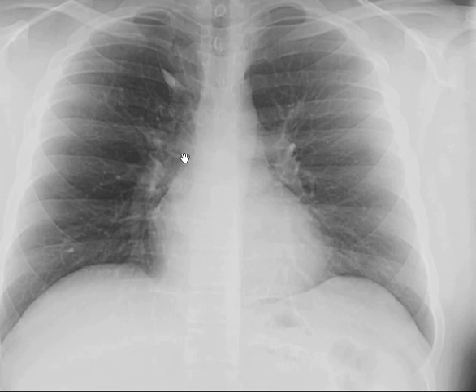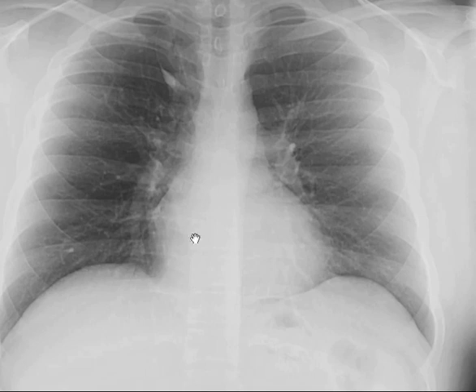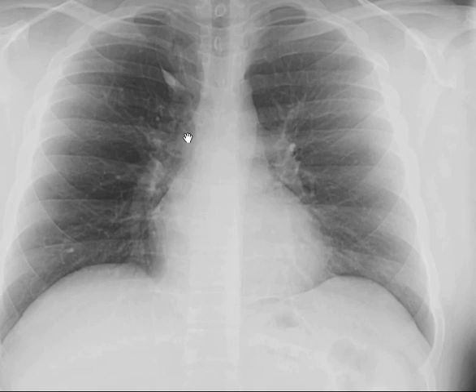Ordinarily you see a little elliptical thing here, very often, coming right at, which is an end-on view of the arch of the azygous vein. The azygous vein hook comes up along the paravertebral area here, hooks up over the right mainstem bronchus, and so you see it kind of pointed at you here as it comes in to join the SVC, the SVC coursing down here.